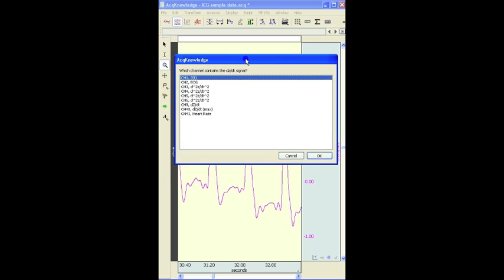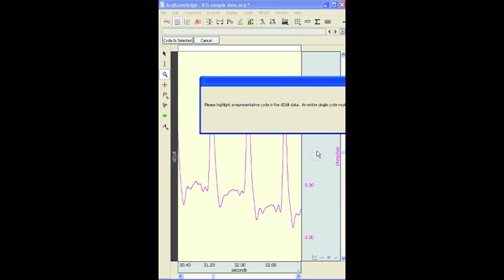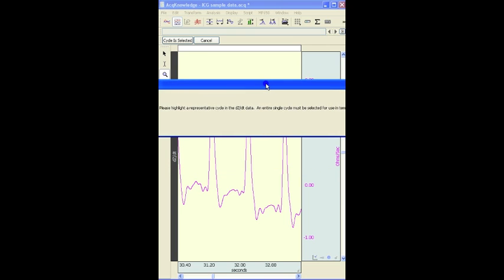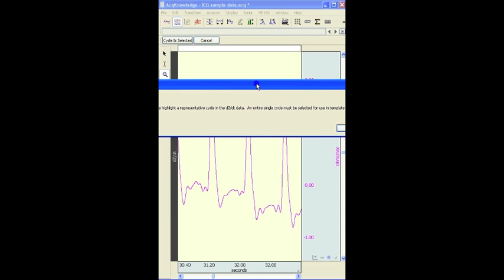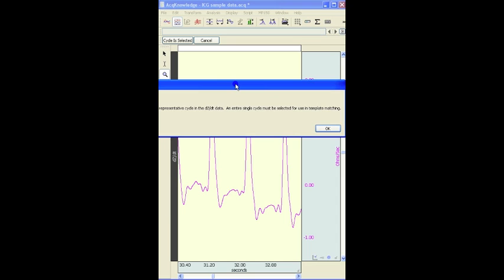The first thing the software wants you to do is to identify the signal that we're going to analyze. In this case, it's Channel 9 DZDT. There are a number of preferences. This first one here is asking us to highlight a representative cycle of the DZDT data.